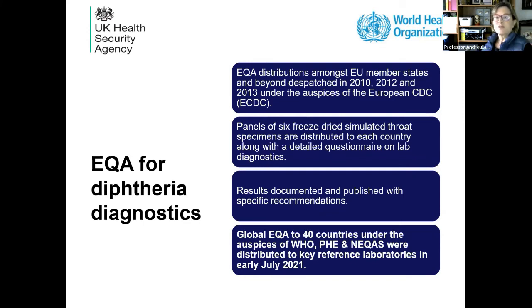So for diphtheriae, we have had distributions, particularly amongst EU member states and also other countries, way back in 2010, 2012 and 2013, under the auspices of ECDC.